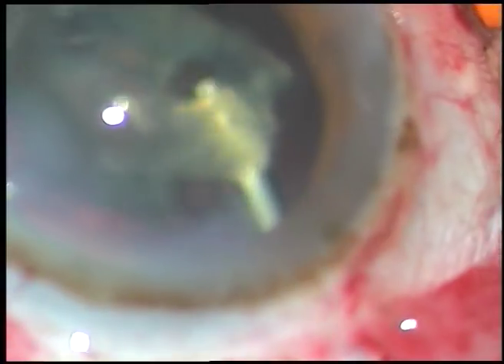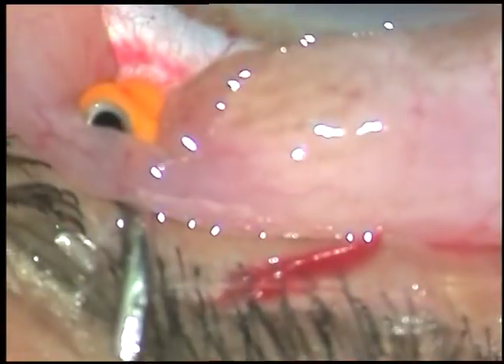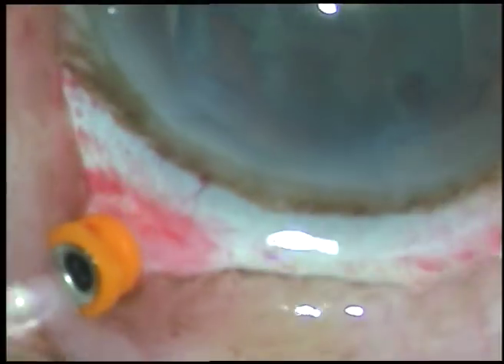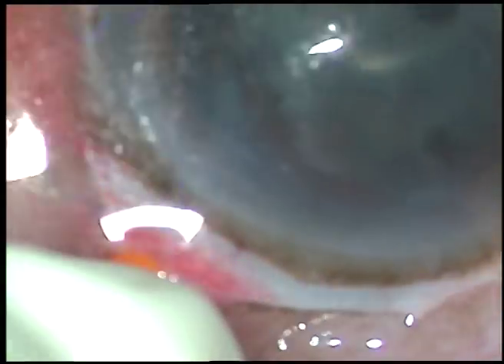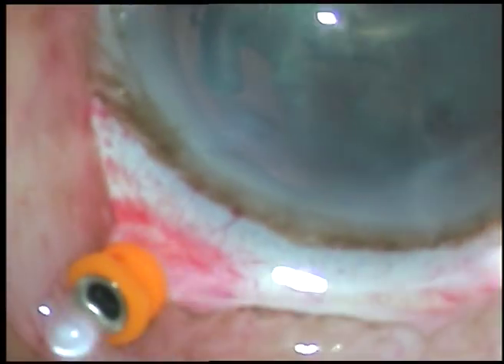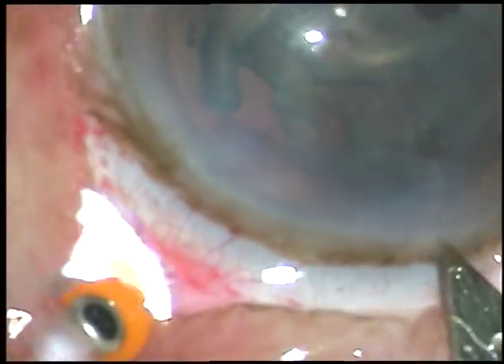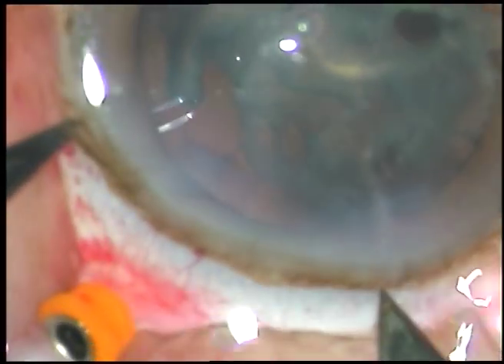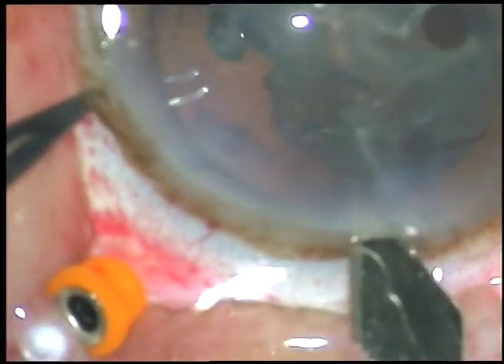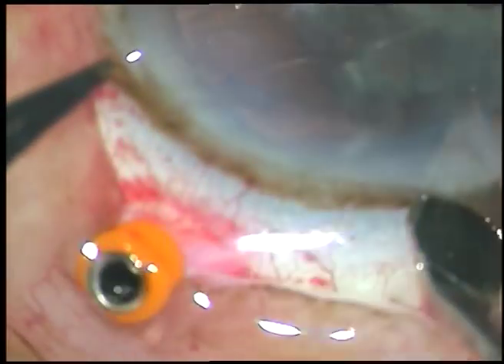And now as I keep it over the iris, it remains there because the fluid is there behind this nuclear piece, and there's a constant current between the irrigation and aspiration and the outflow through this trocar. So I have planned to enlarge the 2.8mm incision and remove the nuclear piece through the limbal incision.